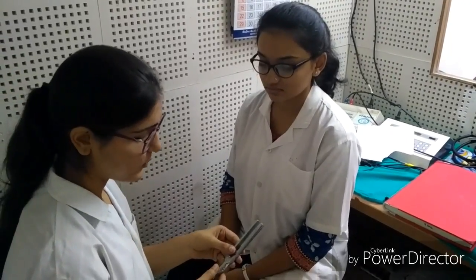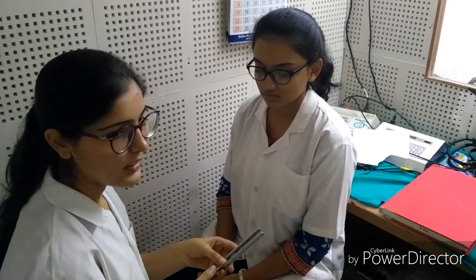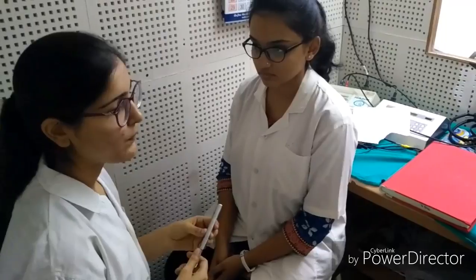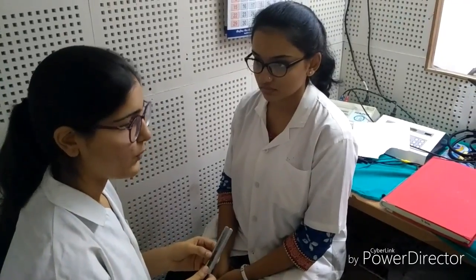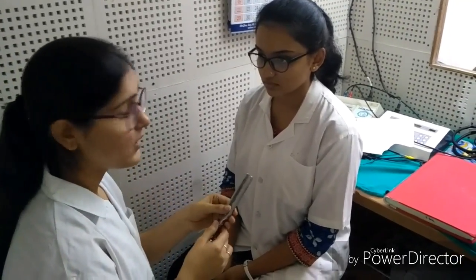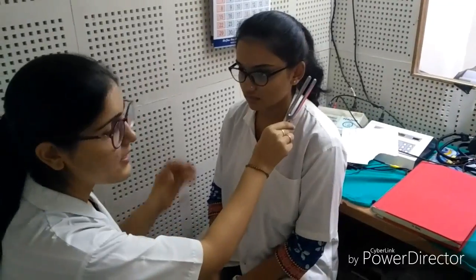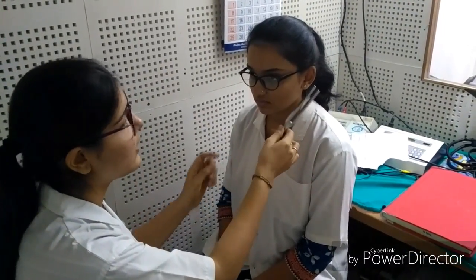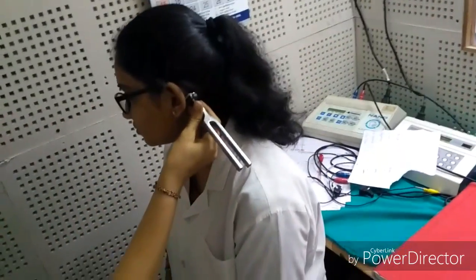First of all, the procedure of the test is explained to the subject. The test is performed with the 512 Hz frequency. The tuning fork is struck over a firm surface like the elbow, patella, or the sole of the shoe. It is not struck over a hard surface like a table because that produces multiple frequencies or overtone. After striking over the elbow, the prongs of the tuning fork are placed about 2 cm away from the external auditory meatus.